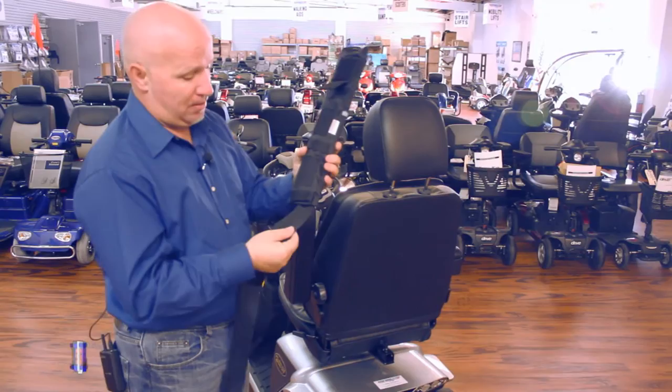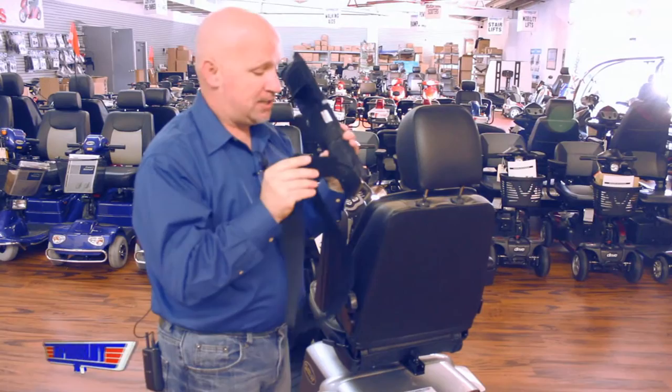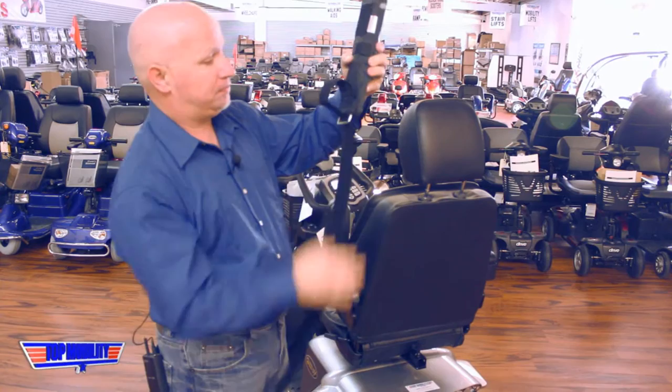First, take your strap with the velcro side in through the bottom loop, bring it all the way up until the buckle reaches. Then take the end of the strap and feed it through the buckle until it's good and tight.